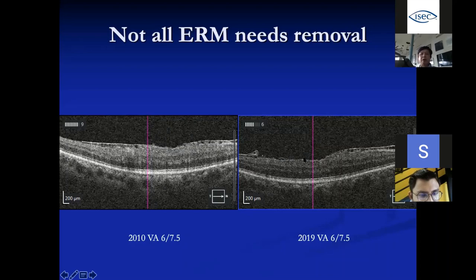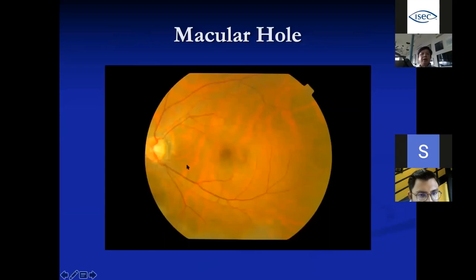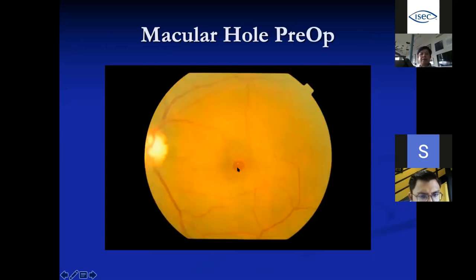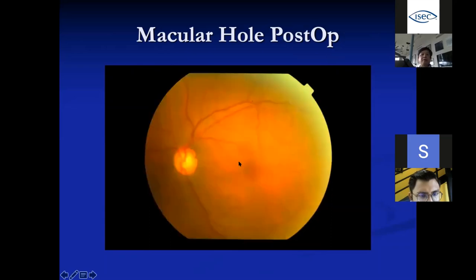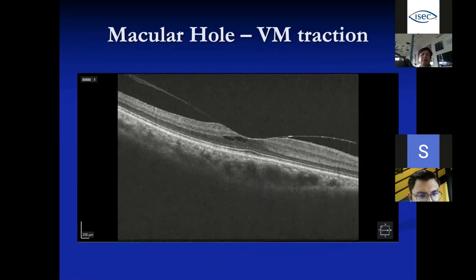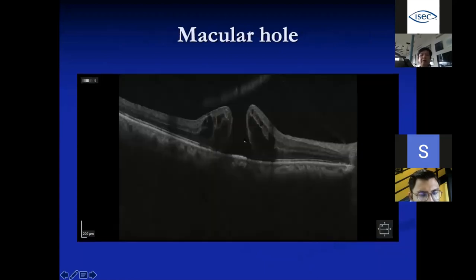A related condition is macular hole — when traction on the macula causes a full-thickness break. In a 3D fundus photo you can see a round defect in the macular region with epiretinal membrane around it. The membrane pulls on the retina and a hole opens up. After operation removing the traction, the hole closes. Not all cases progress to full-thickness hole — some just develop cysts, and we must monitor. Once a full-thickness hole forms — where there is no outer retinal substance between the inner retina and the RPE — operation is required.